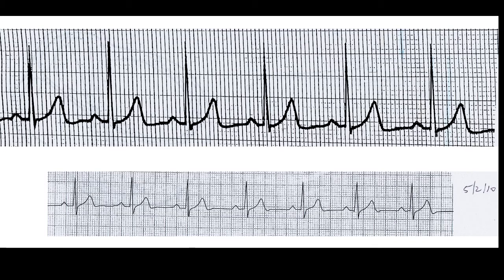So we're looking on page 2 in the course pack, and we're looking at a couple of rhythm strips on here, which would be, again, rhythm strips would be a single lead, and then we'll talk later in the course about 12 leads, but for this material we can use rhythm strips, and on your exam you'll have, for measuring the rate in intervals, you'll be looking at rhythm strips. On page 2, then the top one I want to look at first, and this is where we can start to measure the heart rate.